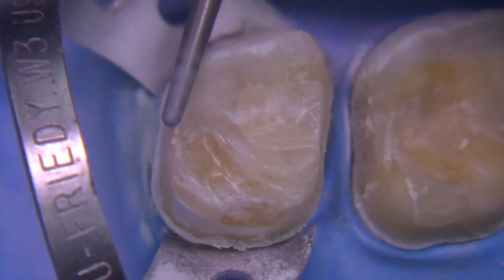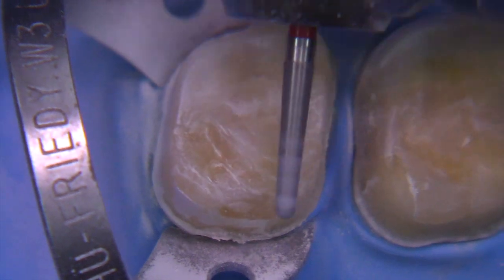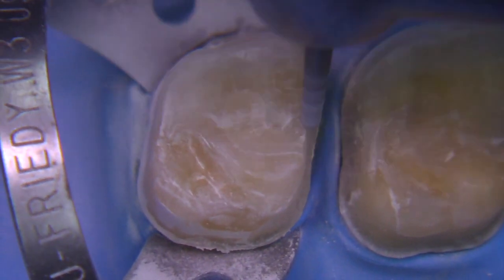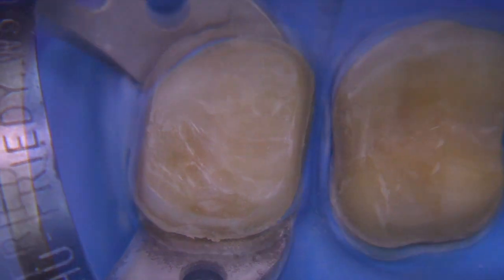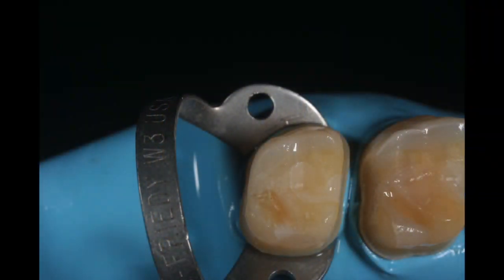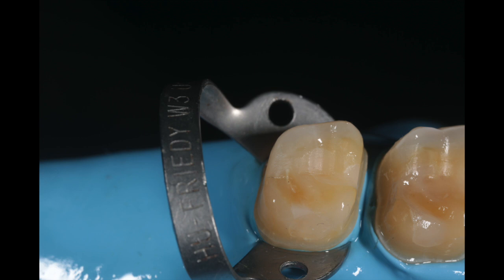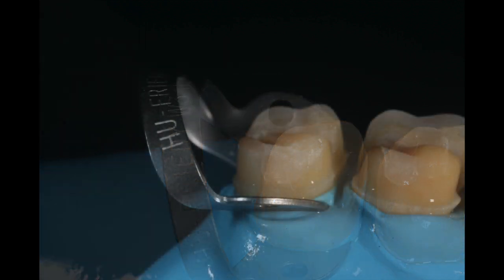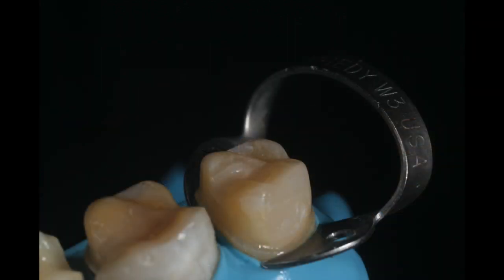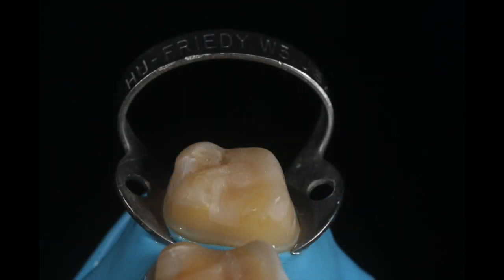You can slow this down on the electric handpiece or even use a slow speed — whatever your preference is totally okay. So here we are with the finished preparation. I like using the rubber dam when I can because it provides such great retraction and access to the margins without the tongue getting in the way. It's been a lot of fun making this video. I hope you all are safe during this pandemic and I wish you the best. See ya!